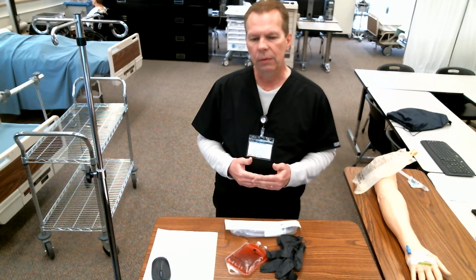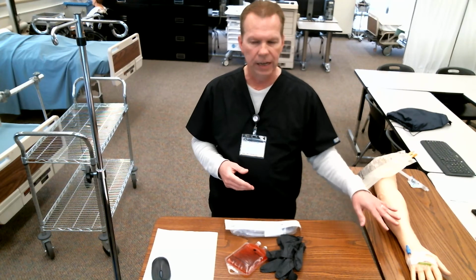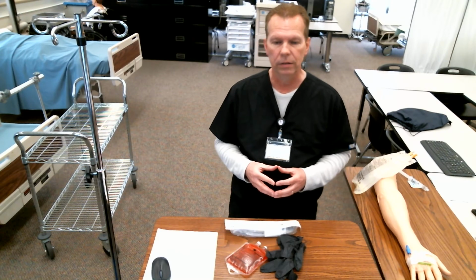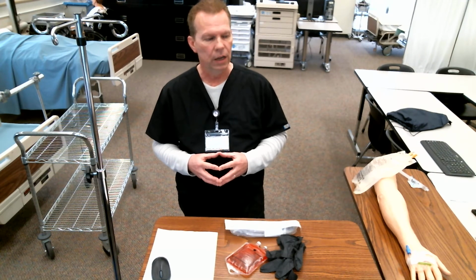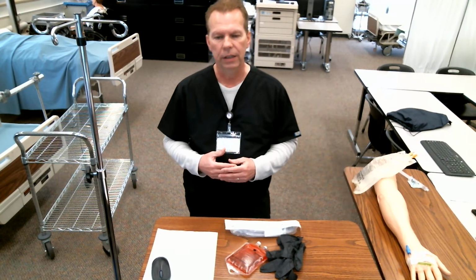Got to make sure that we have type and cross. Can't get any blood without the type and cross. So I'm going to make sure that my patient has a blood band on them. If they do not have a blood band on them, then we're going to stop the process. We're going to know that something was wrong here, because I've got an order to give this patient blood, but the patient has no type and cross, they have no blood band on or anything like that.